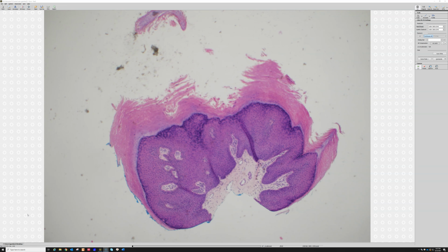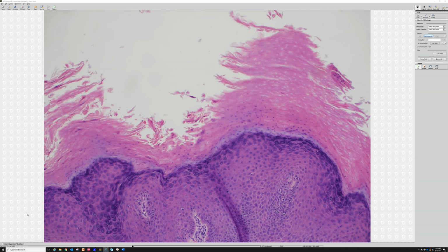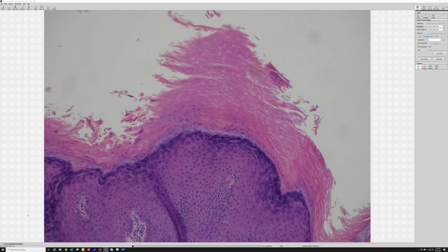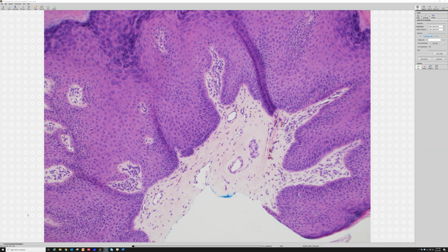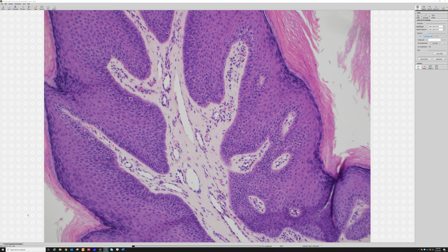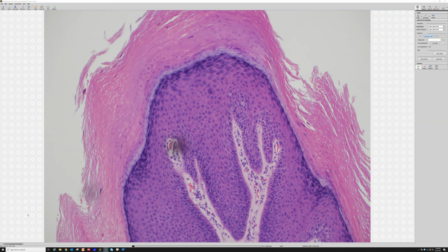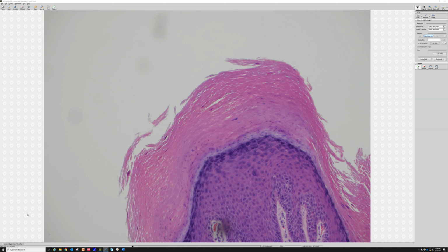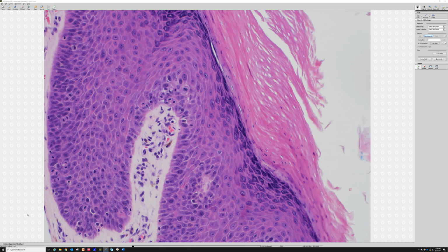There's a spire of para right there. There's a little bit of para there, but it's mixed with ortho. So again, that mixture of alternating ortho and para. Dilated blood vessels. Now, other things can have dilated blood vessels too, okay? But I do find that a helpful feature for verruca. There they are again. See, there's really nice big dilated blood vessels here going up into that polypoid area. Hypergranulosis, but not very chunky and coalesced, a little bit, and no good coilocytes in here at all.